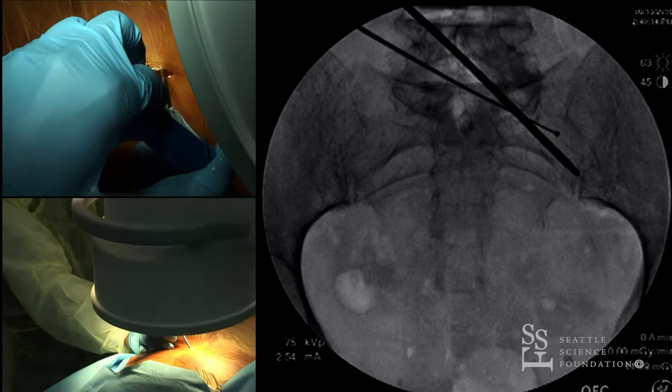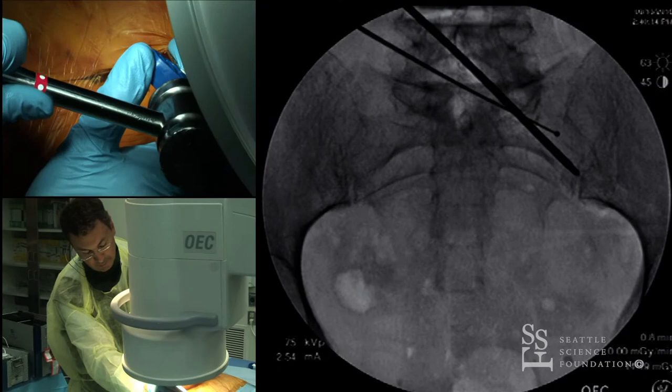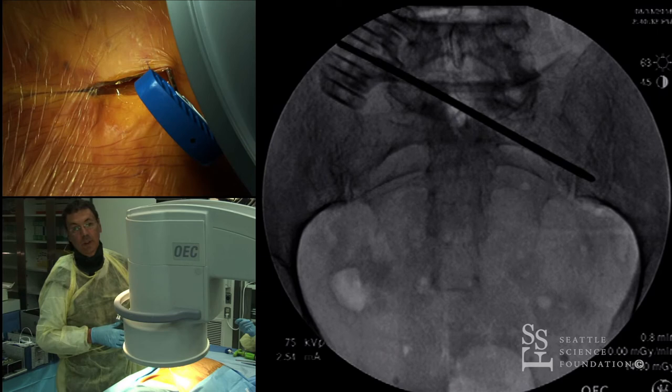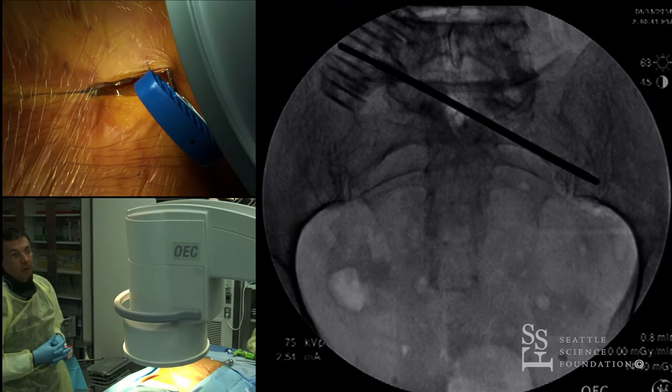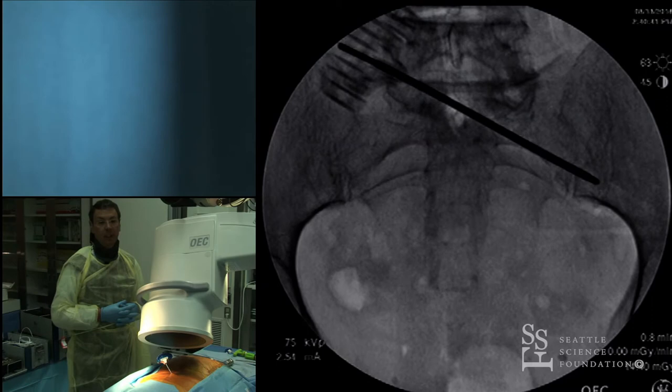Once you get there, make sure you feel that you are in the iliac pillar, then start establishing your entry point. First, confirm you are not getting into the sciatic notch. As seen here, once you've crossed the joint you're in the iliac bone itself. Then look for the teardrop image — you need two images: the inlet view at five to ten degrees, and the teardrop view.